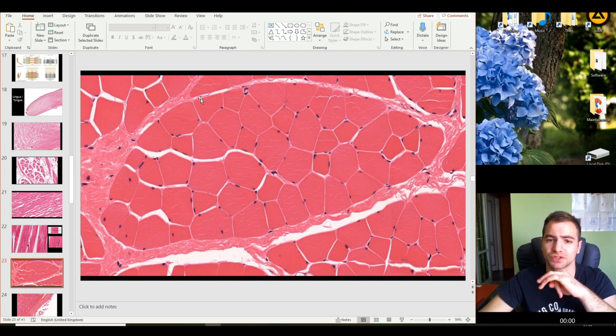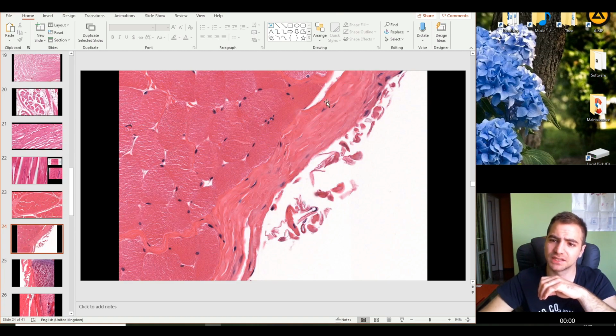So, surrounding this, we're going to find the perimysium. This is the thin connective tissue. And lastly, here, this is the epimysium, the top. The epimysium is continuous with a tendon, and we can see how this epimysium is invading. Follow the mouse. Epimysium is dense connective tissue, and it penetrates inside the structure of the fascicles.